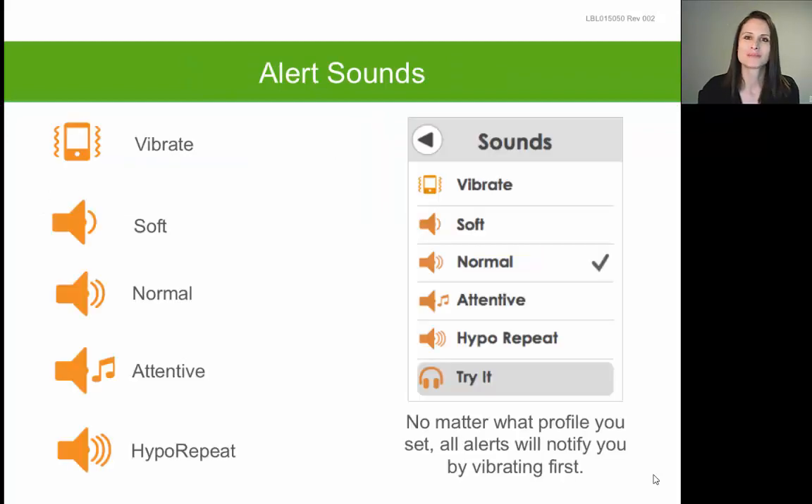Once you've accessed the main menu, tap on the option of Sound to see a list of sounds you can choose from. One of the first options is Vibrate, which means your receiver will vibrate every five minutes until you clear or silence the alert. The one exception is if your glucose hits the urgent low alert of 55 — the first alert will be a vibration, but if you miss it, it will result in an audible beep five minutes later.